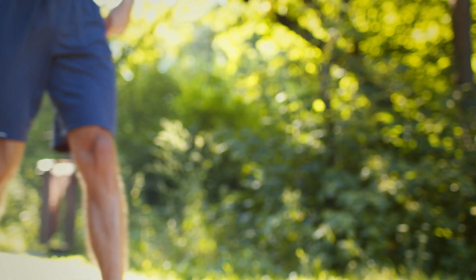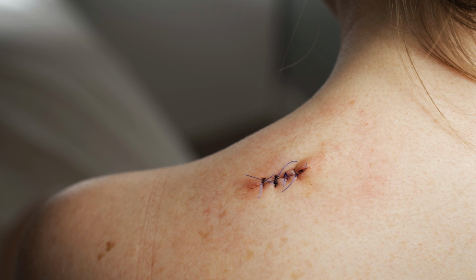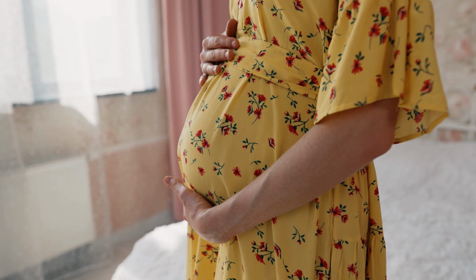Ultrasound, on the other hand, has a heating element to it, so you don't want to put it on any acute injuries when it's in that heating stage. So you don't want to put it on an open scar, you don't want to utilize it with anyone who's actively pregnant over that area, and you also want to make sure you're not doing it over any altered sensation area. Utilizing electrical stimulation and ultrasound combined with your physical therapy treatment can help you return to your prior level of function or help you achieve your goals quicker.